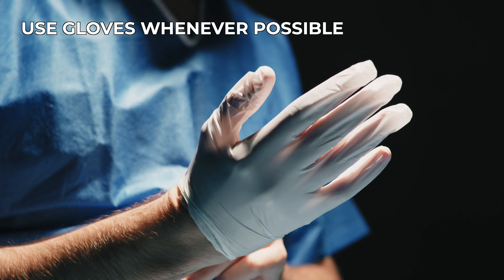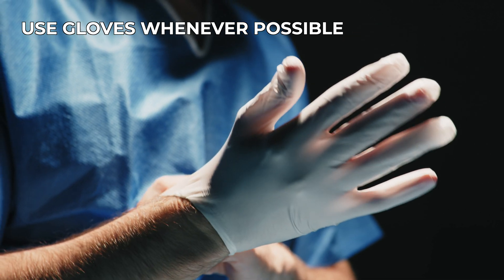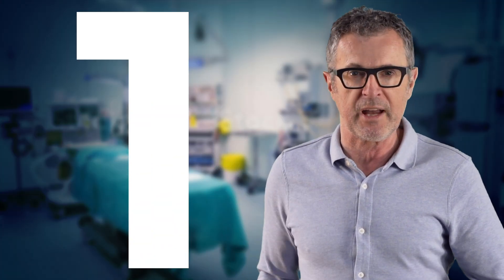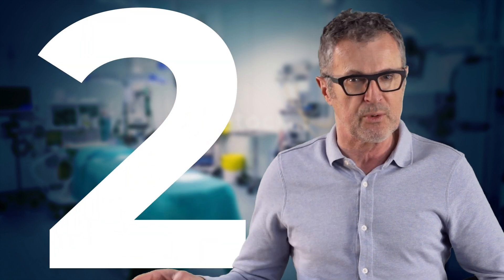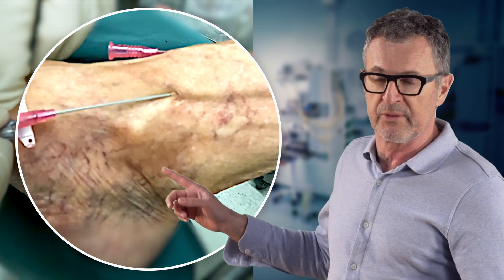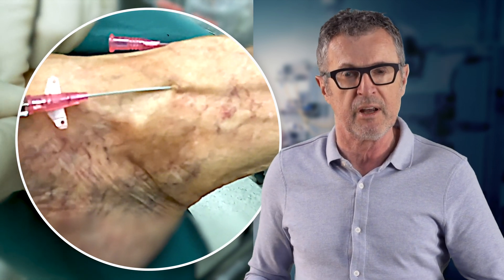Do use gloves whenever possible to prevent catheter and insertion site contamination. And keep in mind these two crucial tips: always use a very low angle of insertion, and advance the needle-catheter system rapidly into the lumen of the vein to prevent the veins from rolling, which occurs with slow needle advancement.